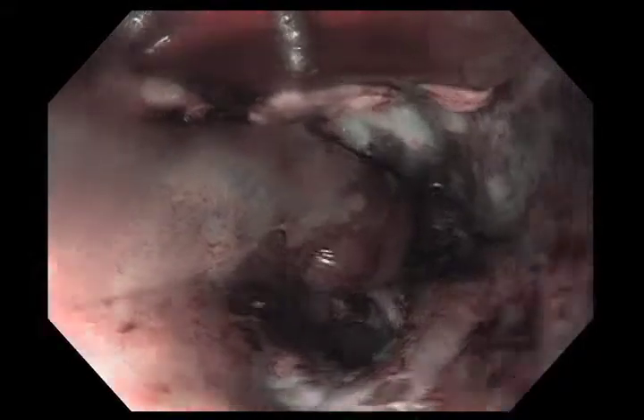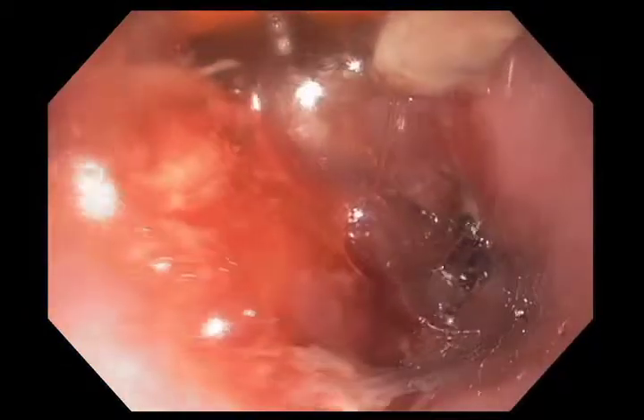This sequence of images is a little bit difficult to get oriented, but I'm basically treating 360-degree circumferential treatments around the GE junction. We had some tongues at the GE junction, and I've moved 360 degrees there to treat those.